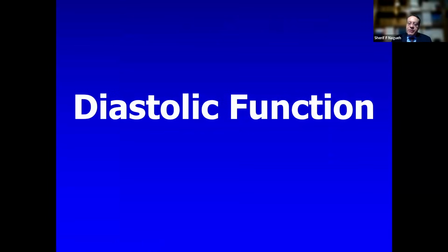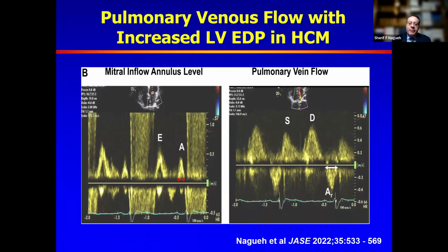Diastolic function assessment is of value or is of importance in this patient population because they frequently have symptoms of shortness of breath, even in the absence of dynamic obstruction. And we can detect different grades of diastolic dysfunction, if you would, in these patients.